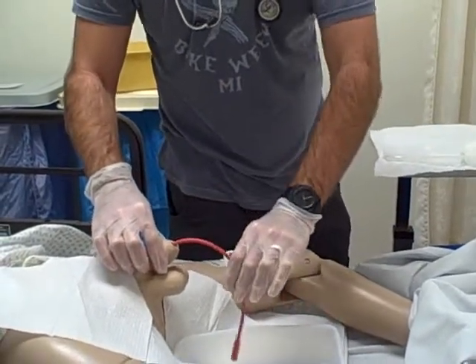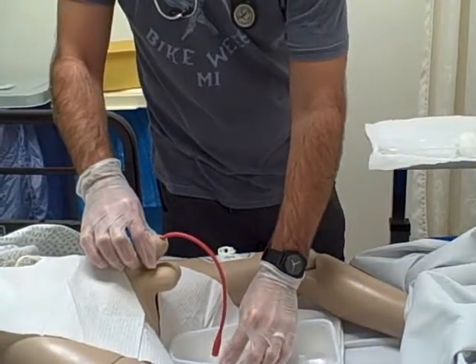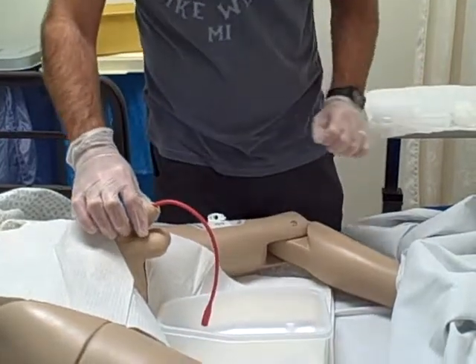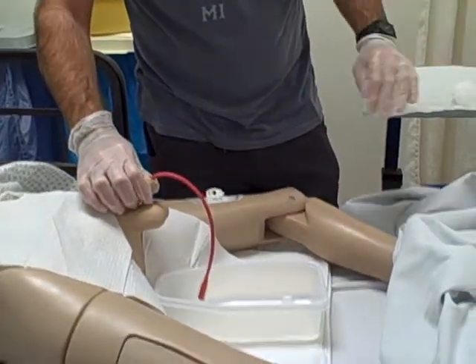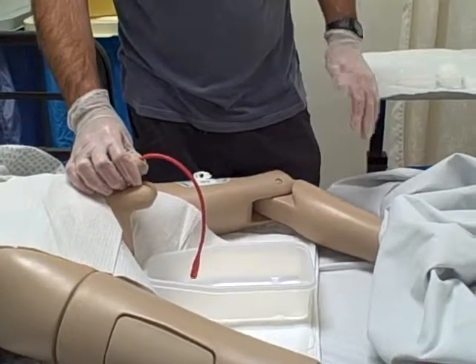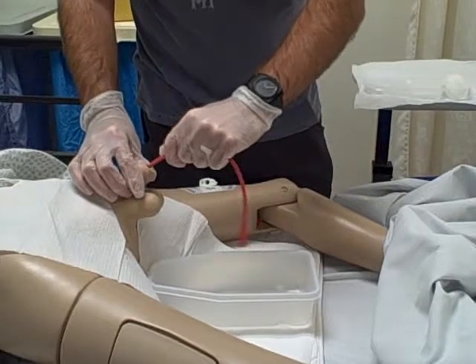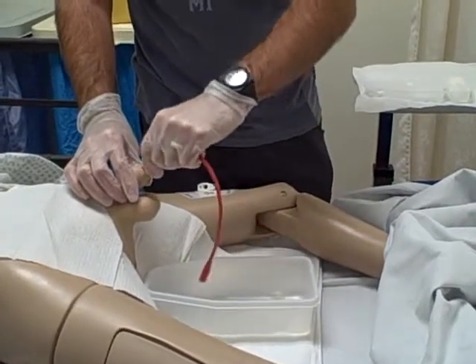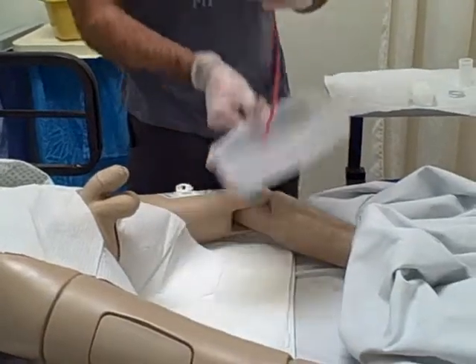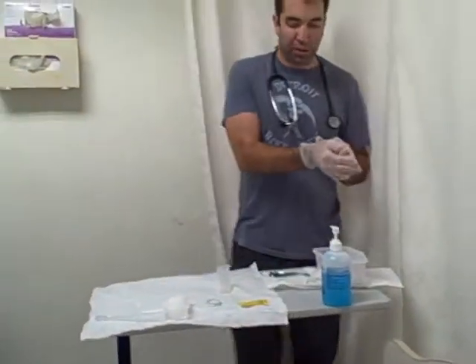Alright, so I have some urine coming out. I'm gonna get my sterile specimen cup, fill that up. We got it over there. So my right hand is still sterile. Alright, so my patient has totally voided, so now I'm ready to take the catheter out. I'm gonna gently pull out. Okay, throw this away. Throw all my stuff away, throw my sterile gloves away.